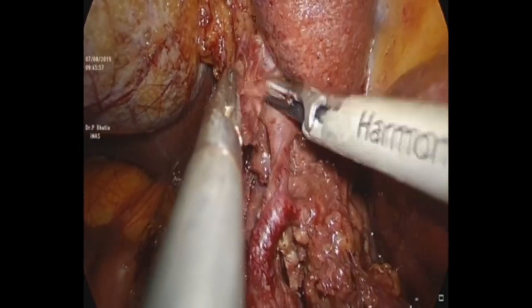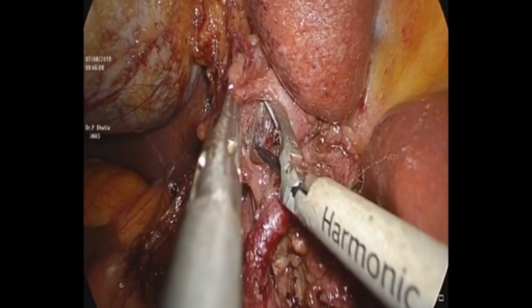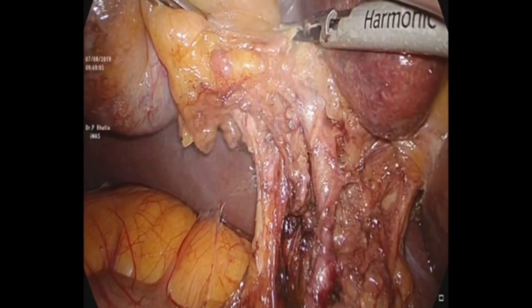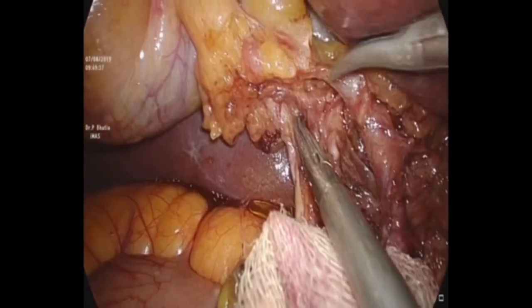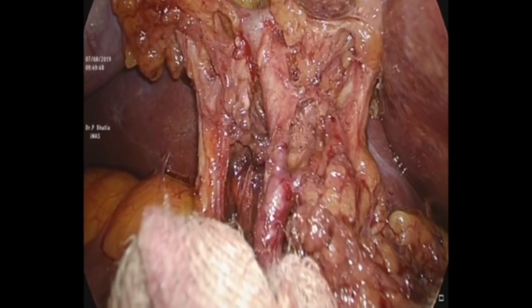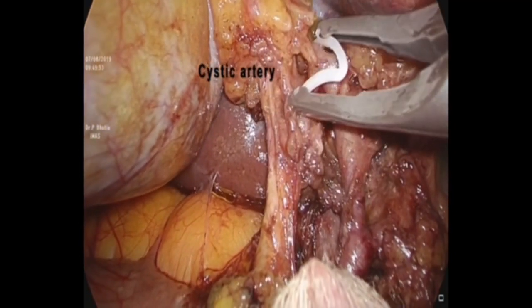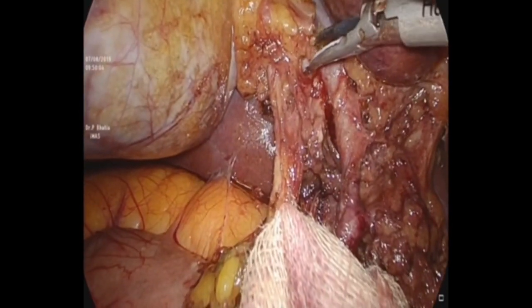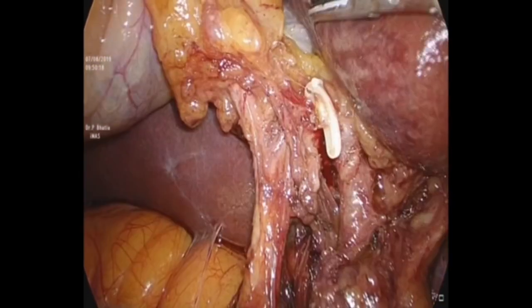One can appreciate that we have dissected the right hepatic artery and are nearing the cystic artery. We apply a clip onto the cystic artery close to the right hepatic artery, and then cut the cystic artery towards the gallbladder. The hepatocystic triangle fibro-fatty tissue has been taken care of.